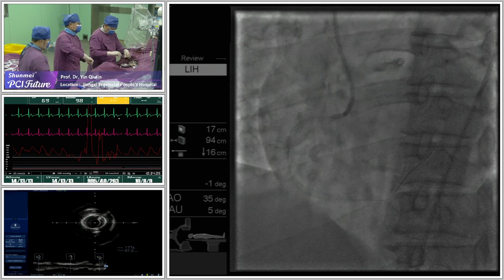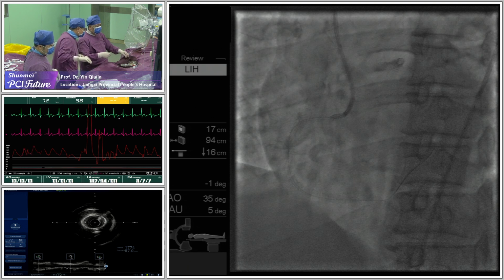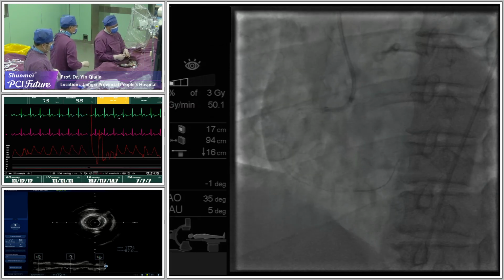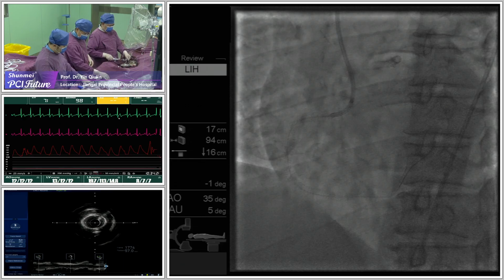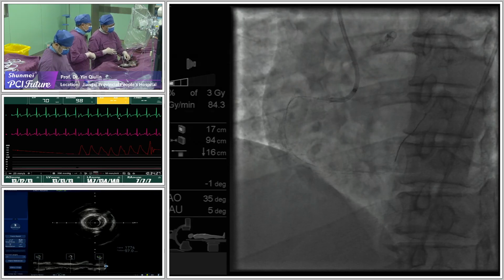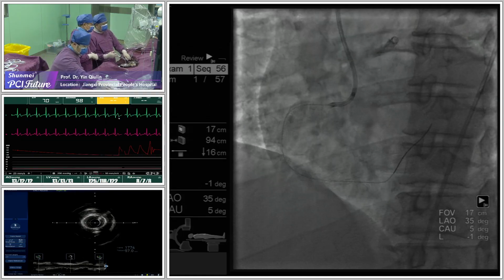MV 90% stenosis, SB 80% stenosis. So we need a 2 stent technique maybe. The advantages: the first is it is simple to memorize. Left main uses the L. The T and Y are routinely used for TY stenting technique.